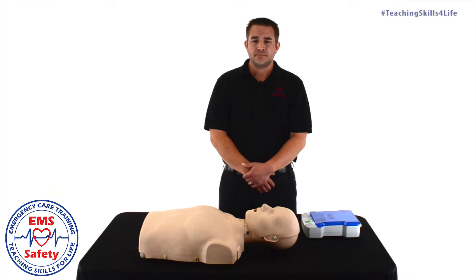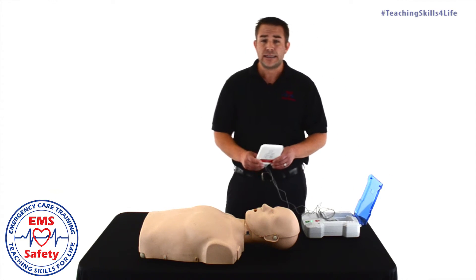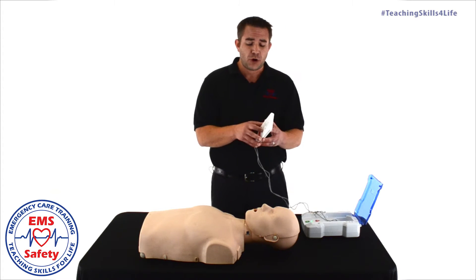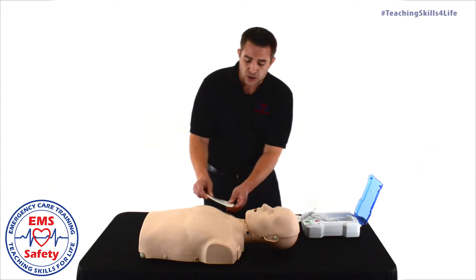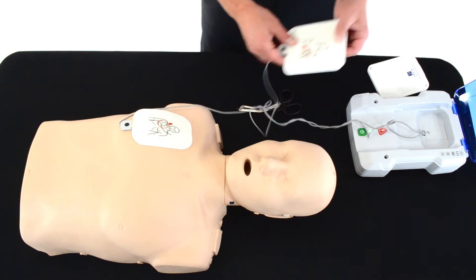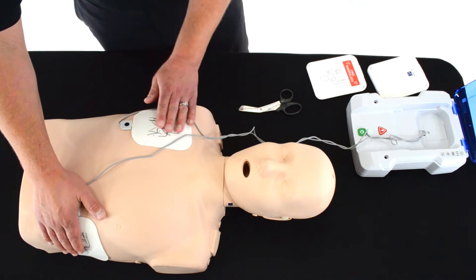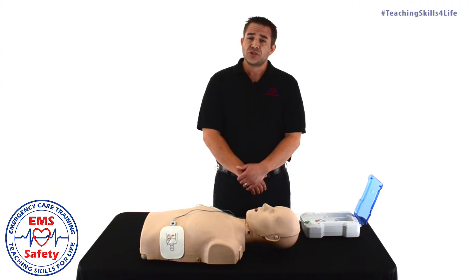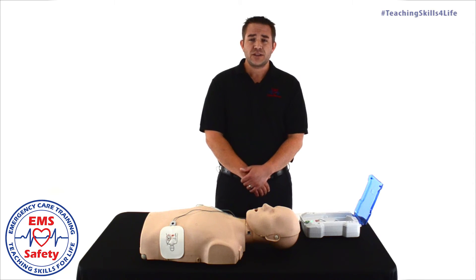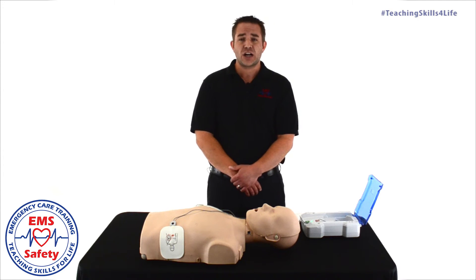We have the chest exposed and we are ready to apply those pads. These pads are going to have diagrams to ensure proper placement. You do need to apply the pads to the upper right chest below the collarbone, and the lower left chest. Now, after these pads are applied, the AED is going to direct you not to touch the victim. It is very important to make sure that yourself and nobody else is touching the victim — it could be a potential safety hazard when that shock is delivered.